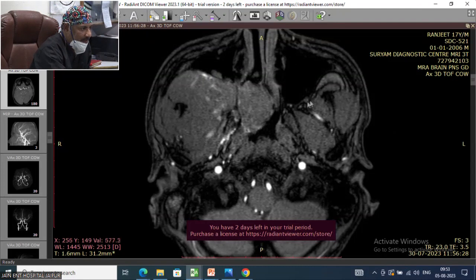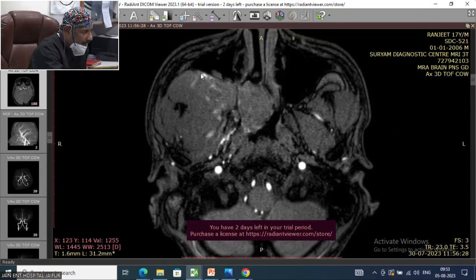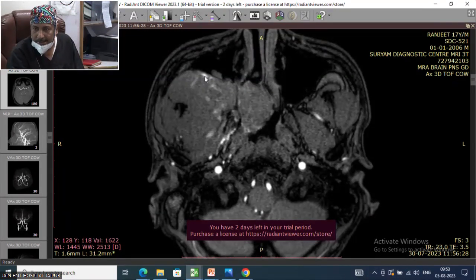Look at the maxillary sinus on this side and see, with tumor expansion behind, what has happened to the maxillary sinus. It has pushed the posterior wall of the maxillary sinus anteriorly. Classical Holman-Miller sign. In the anterior most part of the tumor, just behind the posterior wall, is the internal maxillary.